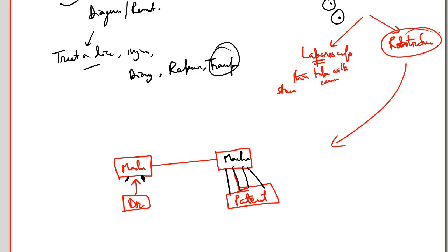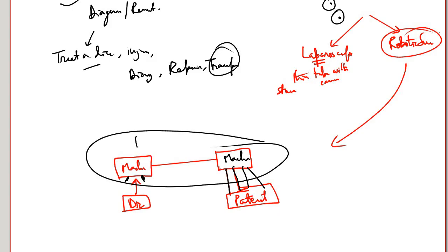So effectively what is happening in robotic surgery is that we are using a computer controlled robotic system. This entire thing is the robotic system, RS, and here we will be talking about the Da Vinci system, which basically assists the surgeon.